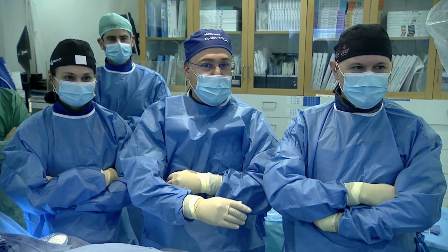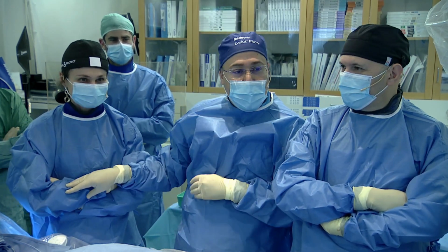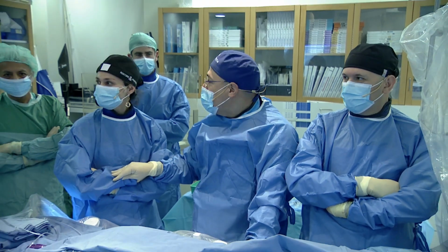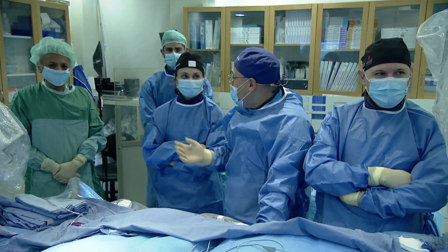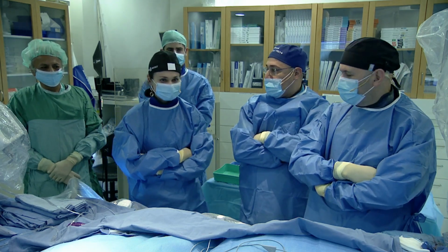So I'll introduce the team. With me, Dr. Rami Jouaba and Dr. Anna Turian, the best team you can have, and Elias Khilo outside. And also with me, Dr. Pradeep Vyas from India. So please, Anna, maybe you would like to present the case.